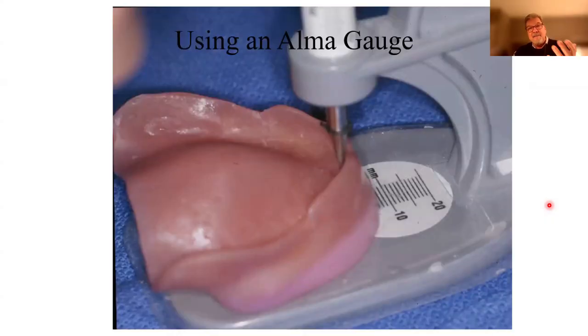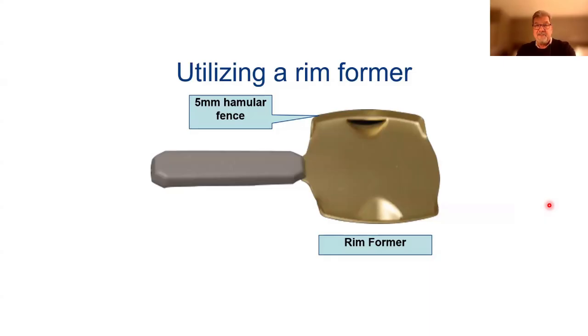When I'm making my occlusal rim in the laboratory, I'm going to use an Alma gauge. I also use an Alma gauge when setting my denture teeth. On average, when you're setting the anterior denture teeth, you're coming out about 8 to 10 millimeters from the papilla. I'm doing the same thing here on this occlusal rim. I put the pin into the papilla, and I see the wax is about 8 millimeters coming out from the papilla. I know this is going to help the doctor in the operatory with a nicely contoured occlusal rim.